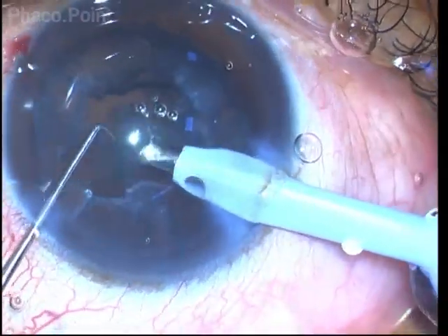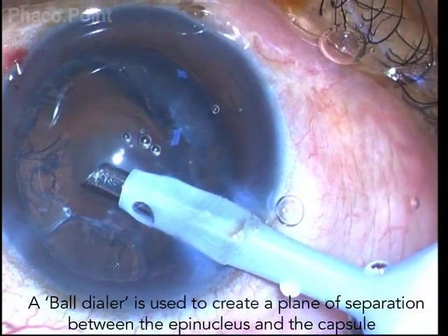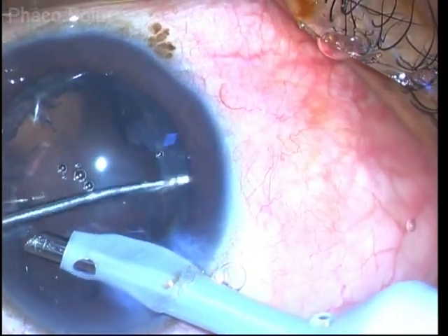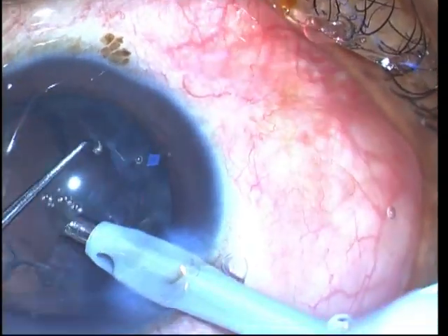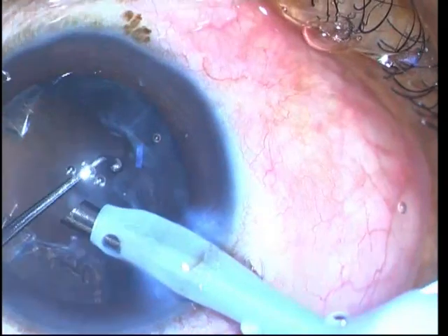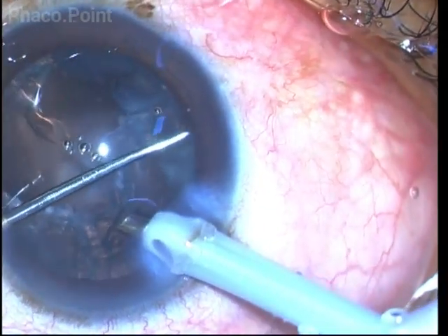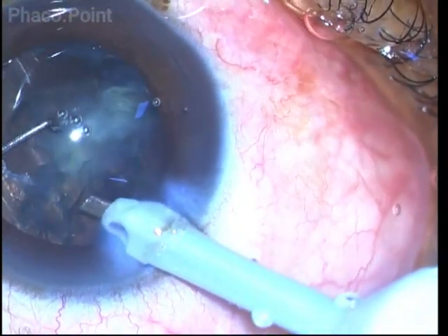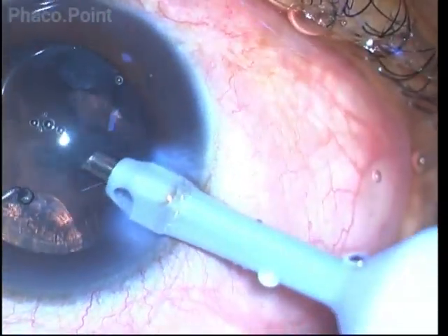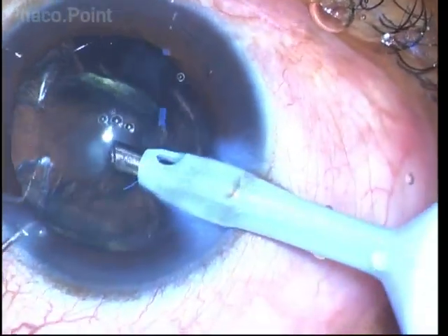We are now left with an epinucleus sheet which would be very difficult to remove. I use a ball tip dialer, go underneath the capsulorhexis edge, and sweep across the epinucleus sheet, trying to cleave it from the posterior capsule. You can use viscodissection as well to lift this epinucleus sheet. But in this particular case, simply with the help of a ball dialer, I was able to separate the epinucleus shell from the underlying capsule, tug on it, bring it centrally, grasp it with the phaco tip, and completely remove most of the epinucleus sheet.